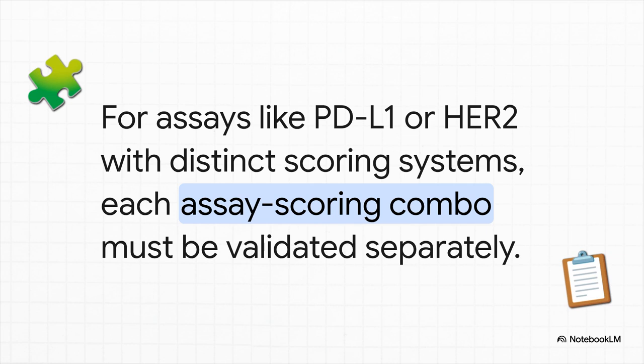The way you score HER2 in breast cancer is totally different from how you score it in gastric cancer. The guideline is very explicit here. You have to validate each one of those unique combinations separately. Every assay, for every scoring system you use clinically, needs its own validation.